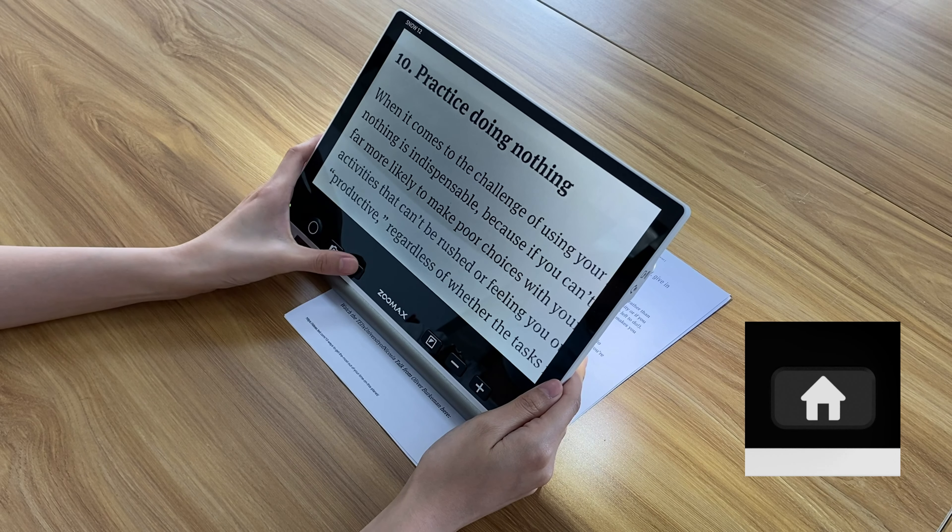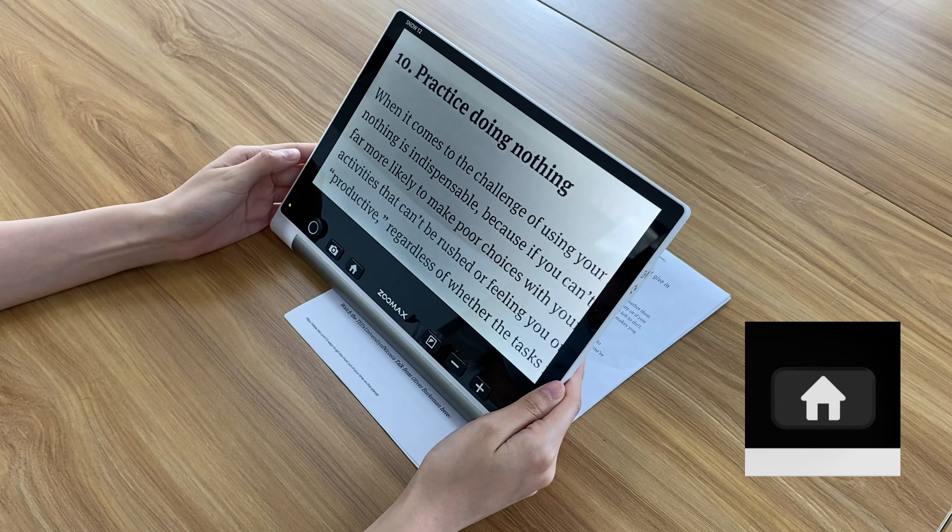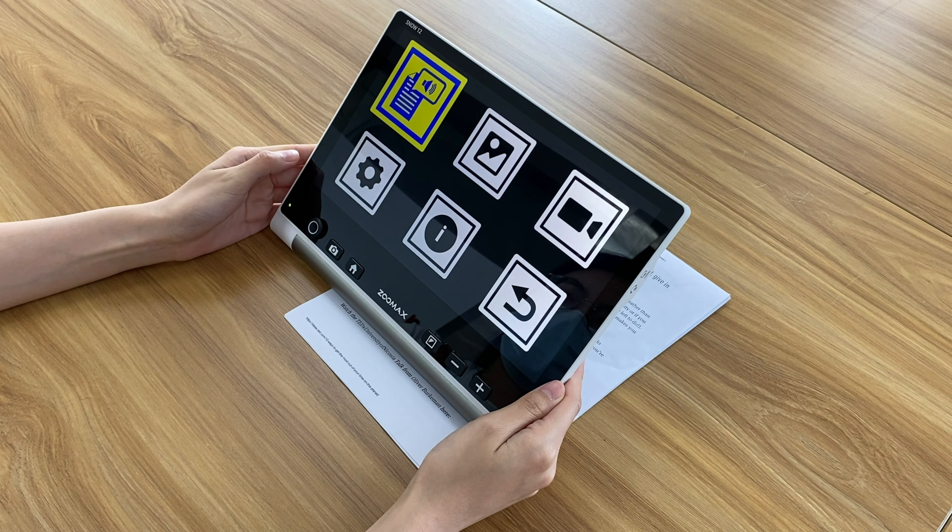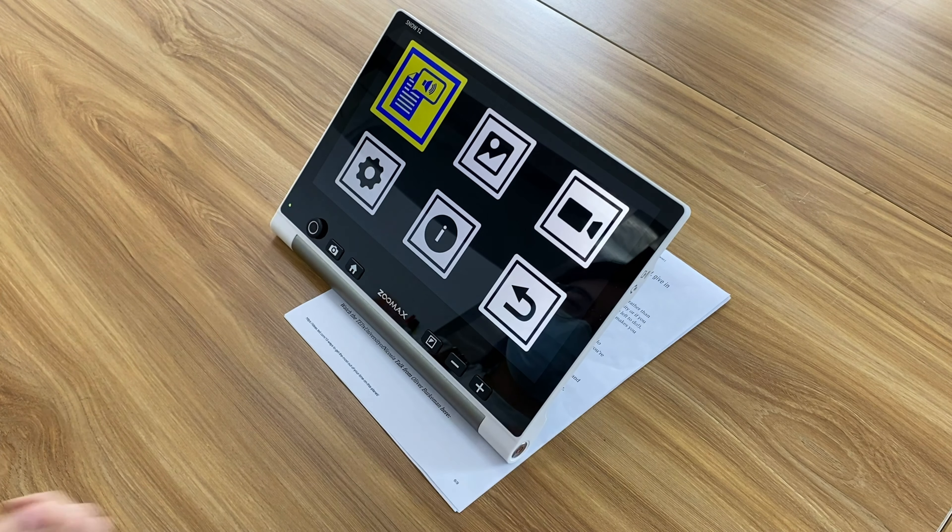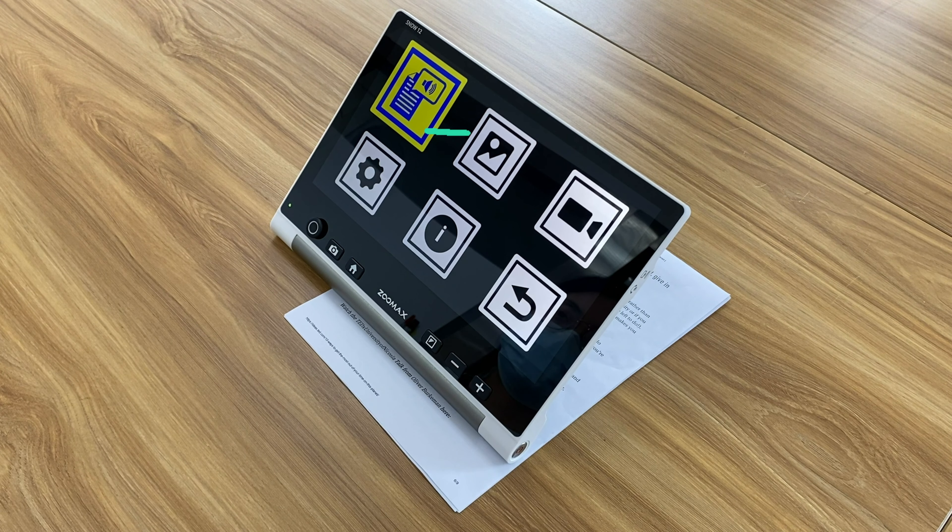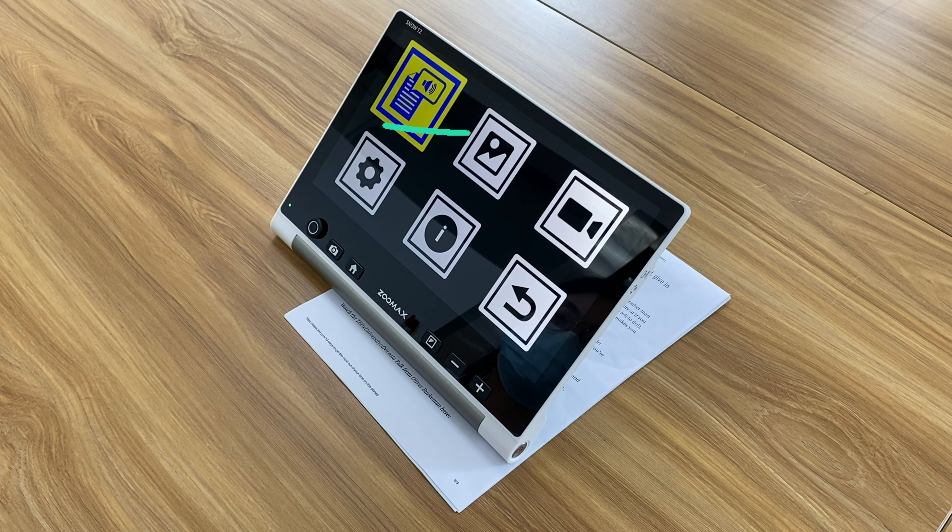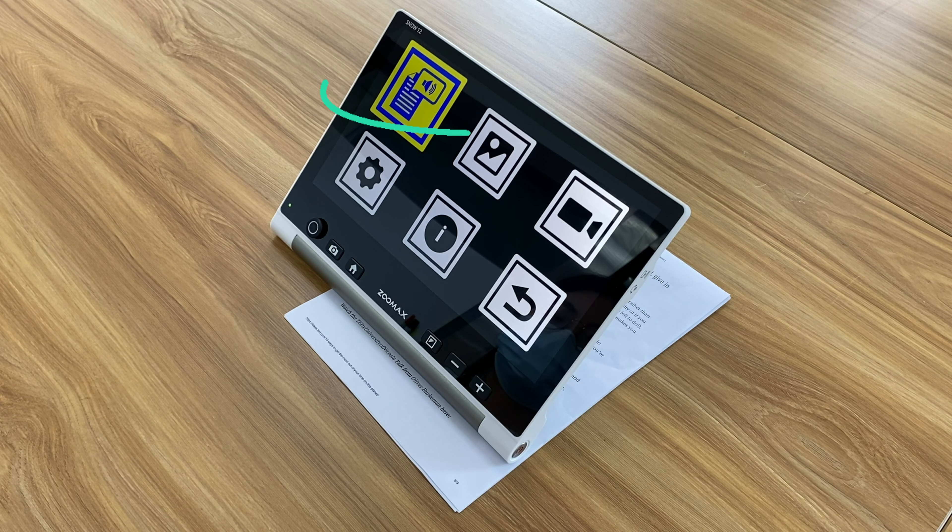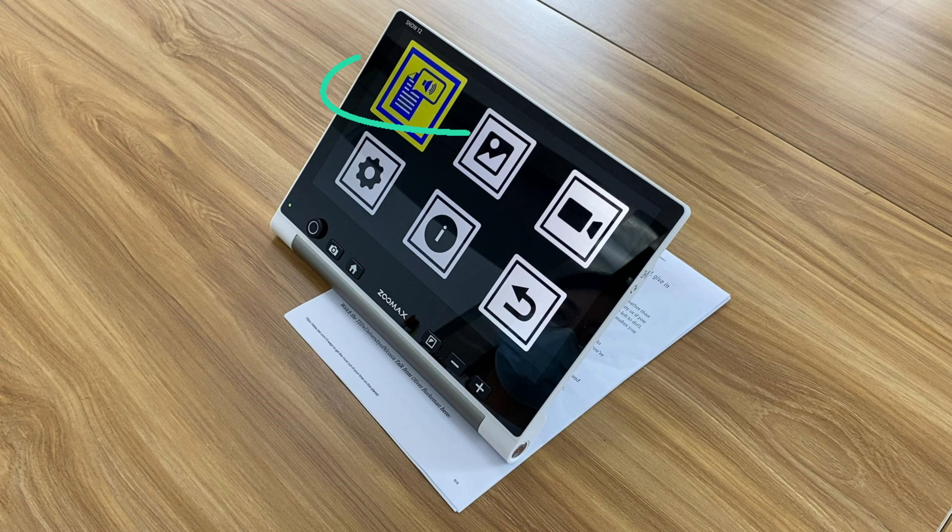When you press the home button, you will find six icons. The first icon represents the OCR text-to-speech function. We will especially introduce this function later.